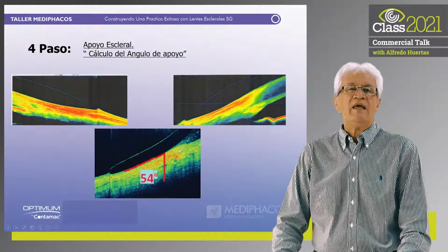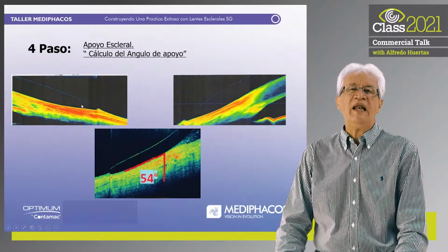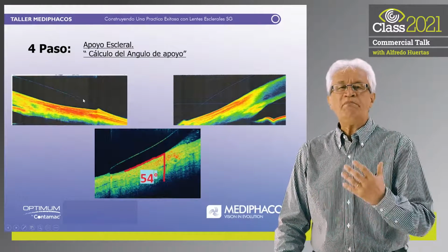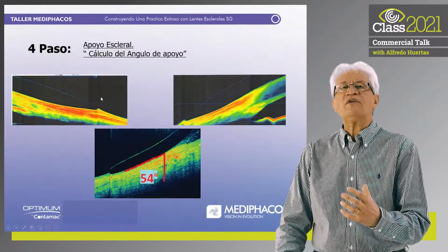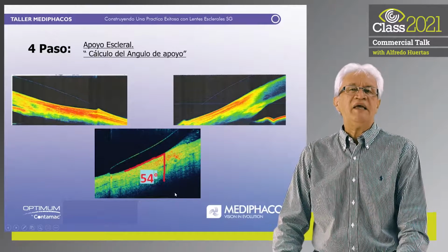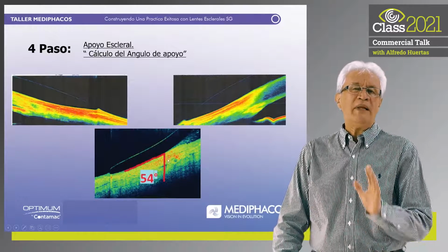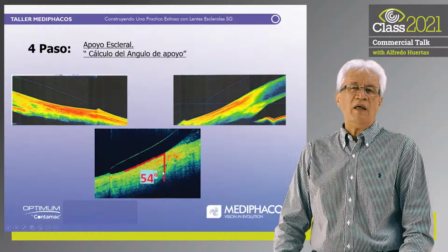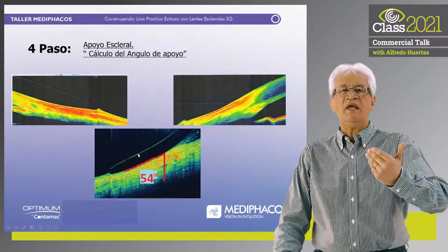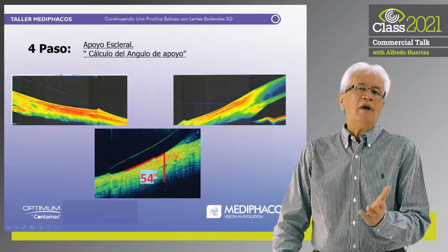For this reason, it is important that we must be very attentive to the lenses that we use, and it is also important to know what designs and determine what designs that we work with. The SG scleral lens has designed a scleral support, which is based on a support angle. The test box pattern is 54 degrees, and when the variation is made at 56 and maximum 60, I am further from the sclera.